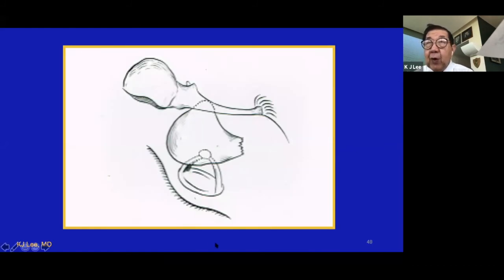As we mentioned before, you can do a lot of middle ear reconstruction, ossiculoplasty, but if you have poor eustachian tube function, it won't work. If you have a good eustachian tube function, using the body of the incus to interpose between the stapes head and your malleus handle can work very well. And I'm sure you have imaginations for other reconstructions. Next.